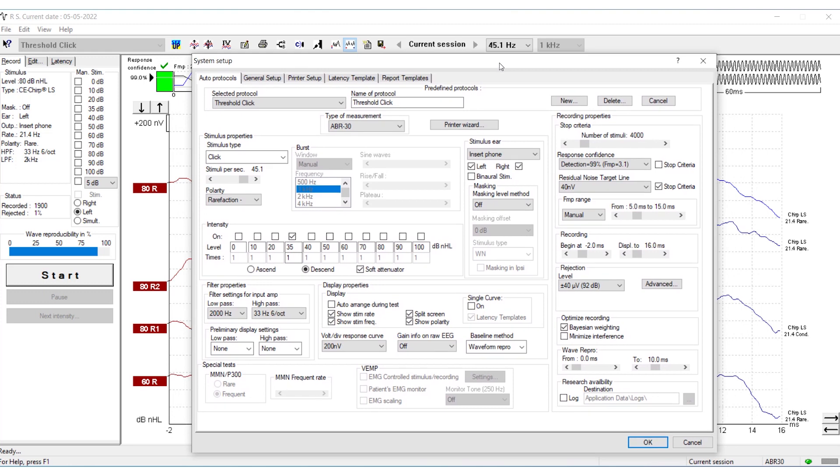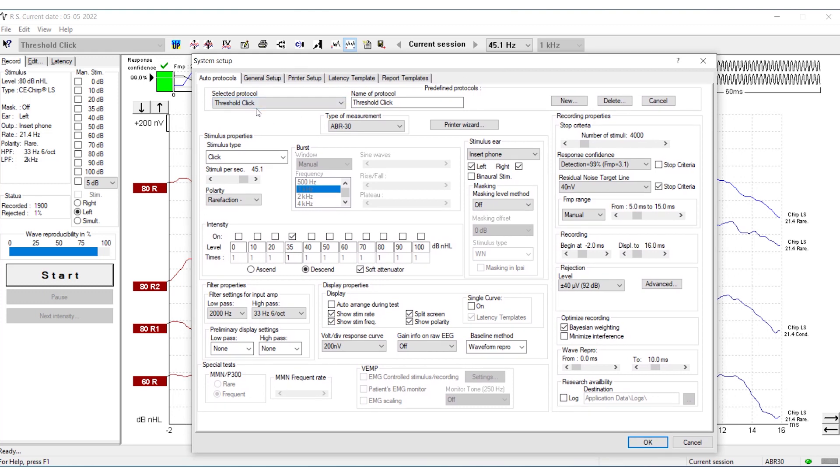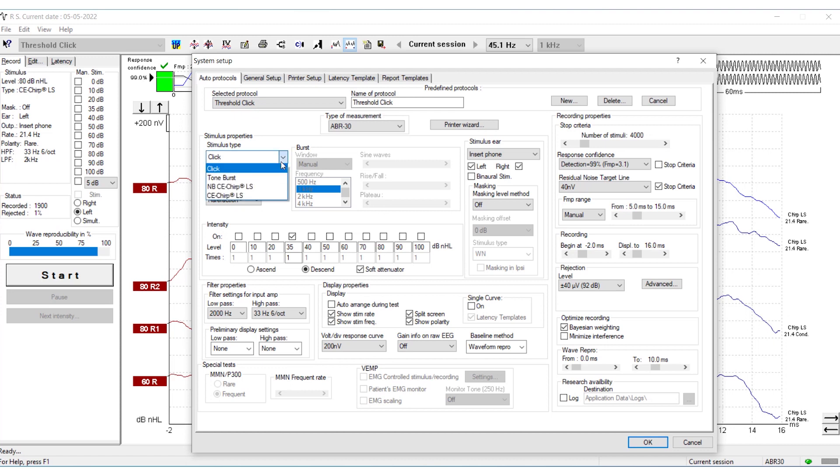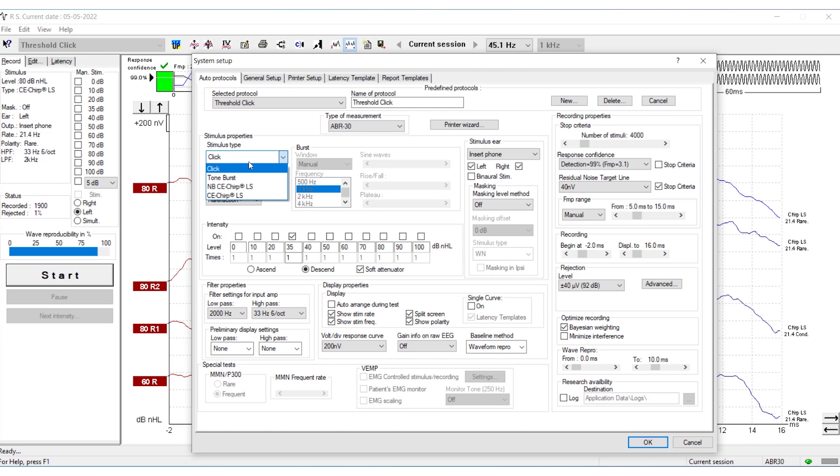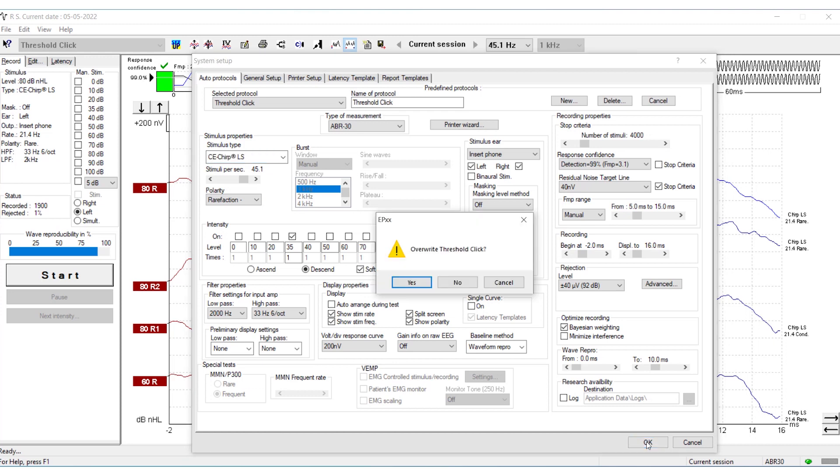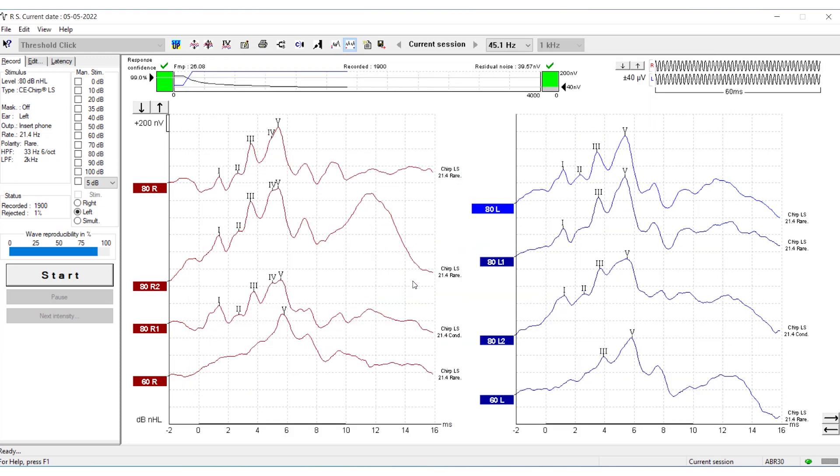By default, the Eclipse has a Threshold Click protocol that uses the click stimulus. If you want to change the stimulus type to CE Chirp, click Stimulus Type and choose CE Chirp. Then press OK and Yes to overwrite the protocol.